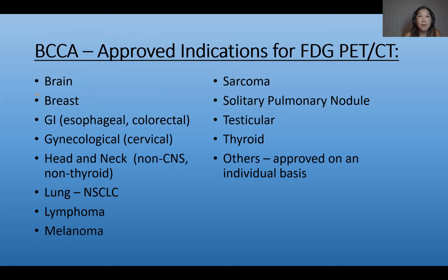So this is the list of approved indications for PET CT using FDG at BC Cancer. I probably don't expect you to memorize this list, but you certainly should be familiar with the types of tumors that can routinely be studied using FDG PET.